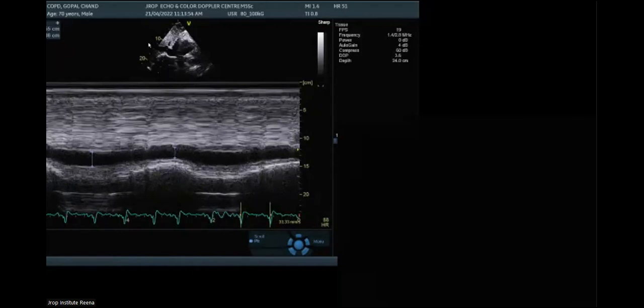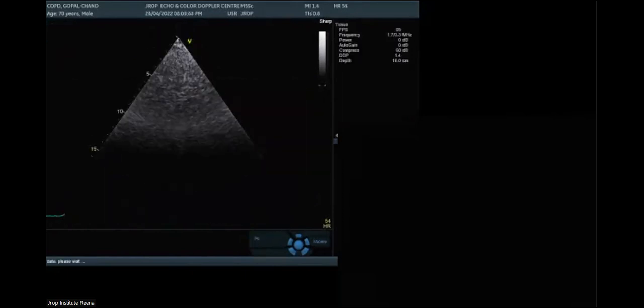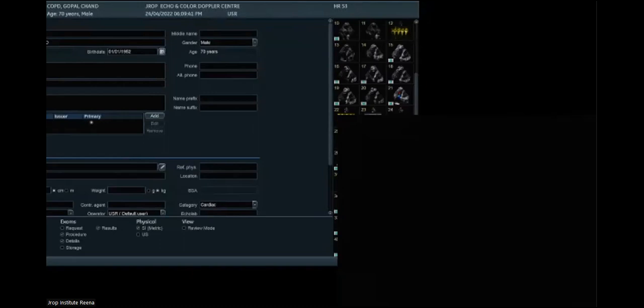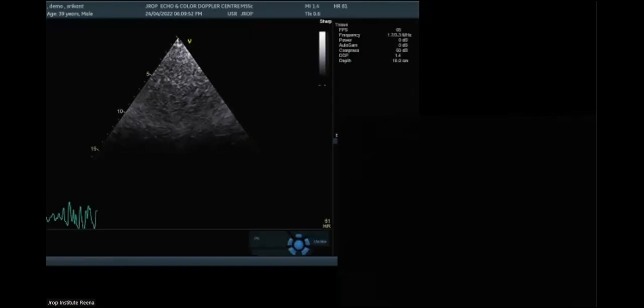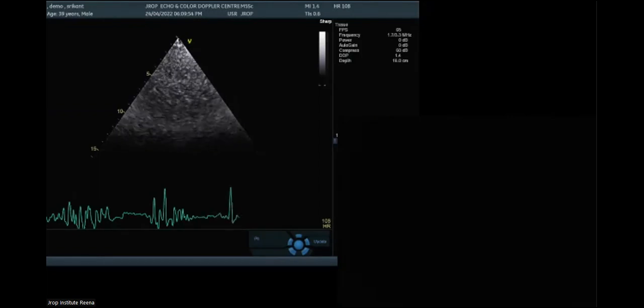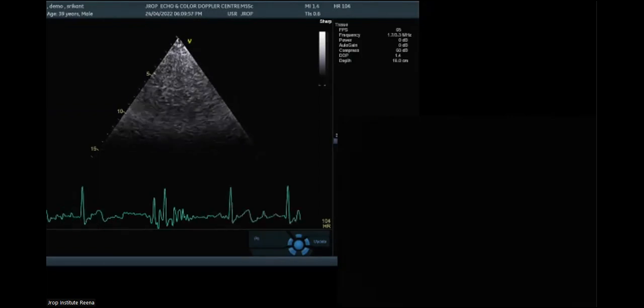Yes, sir. The next question is, sir, identifying the anteromedial, the posteromedial and anterolateral papillary muscles in short axis. Like, should they be considered? It's a very simple thing. I'll show you. It's not a difficult thing. I say you remember in a better fashion. Keep on looking at my views because this is more important.